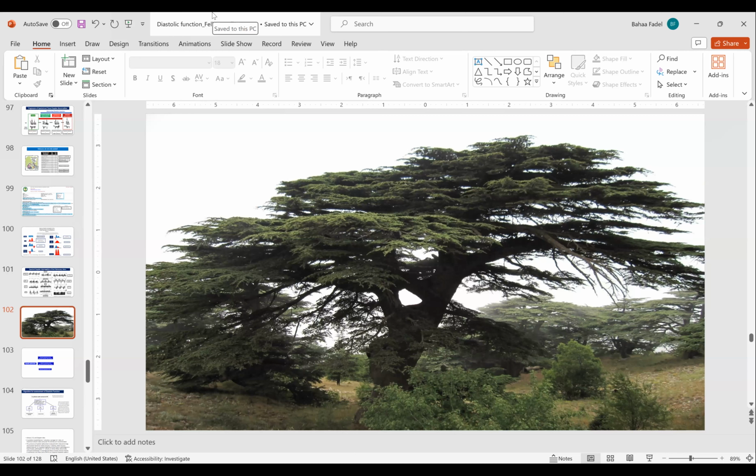The problem is when you have severe tricuspid regurgitation and a triangular shape signal across the tricuspid valve, you will not be able to assess the patient's pulmonary pressure. Yeah, exactly. It was the same finding, but I wasn't sure how I can differentiate it from primary right-sided pathology by echo. You have to look at what I showed you here. You have to look at the left side. It was very difficult because it was in fast AF. That's my problem.